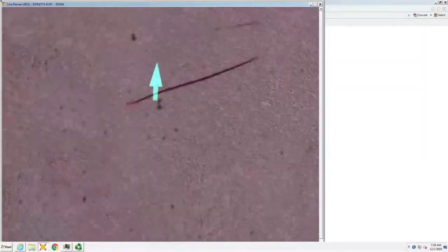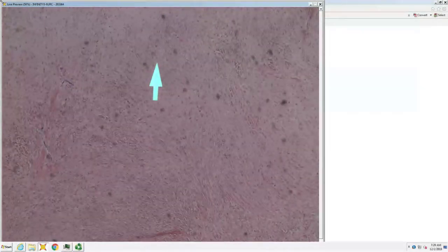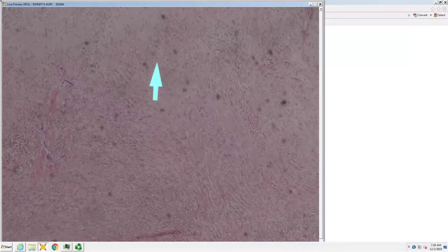So it wouldn't be wrong to call this pleomorphic fibroma, but when it has the blue hue and it has the same fibroblasts in a large hypocellular nodule, desmoplastic fibroblastoma is a term used for that. So it's related to pleomorphic fibroma. It's benign. The fibroblasts tend to be CD34 positive, but large and stellate. And it has a hypocellular nodule, often with a pale amphophilic hue.